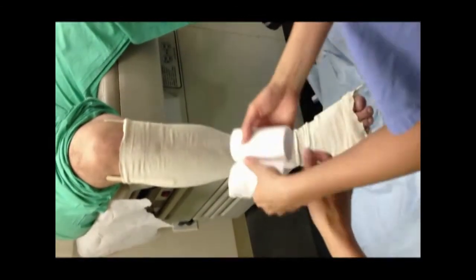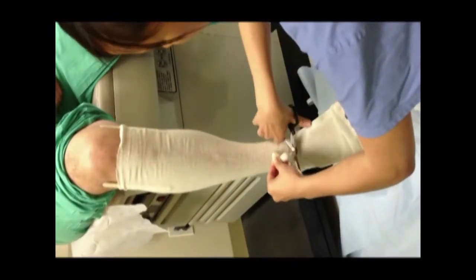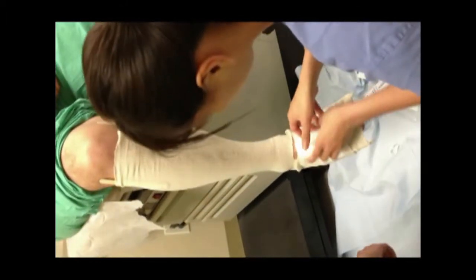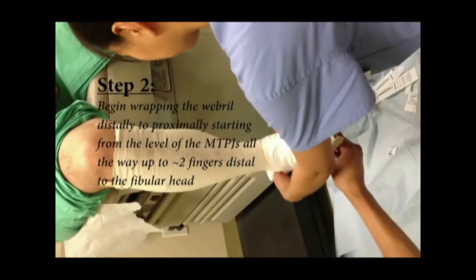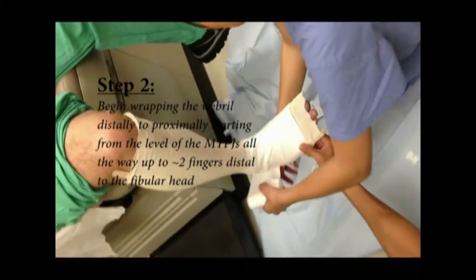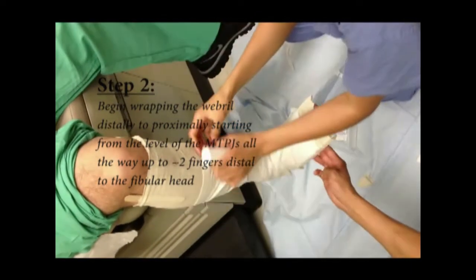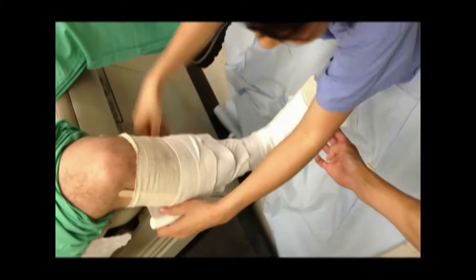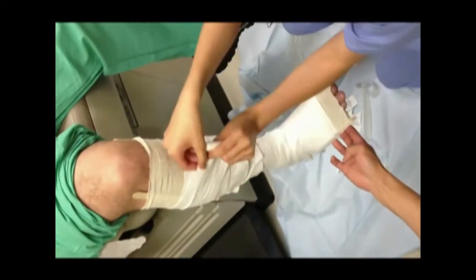You can take some web roll, or you can make a cut there too. With the web roll, you want to start going from distal to proximal. If you have the patient try to flex his foot just a little bit to 90, it will help you when you have to do it yourself, because then they won't be fighting it when you put the plaster on. What we're looking for here is the fibular head, and we want to be just about two finger-breadths from the fibular head, because we don't want the cast going up too proximal.